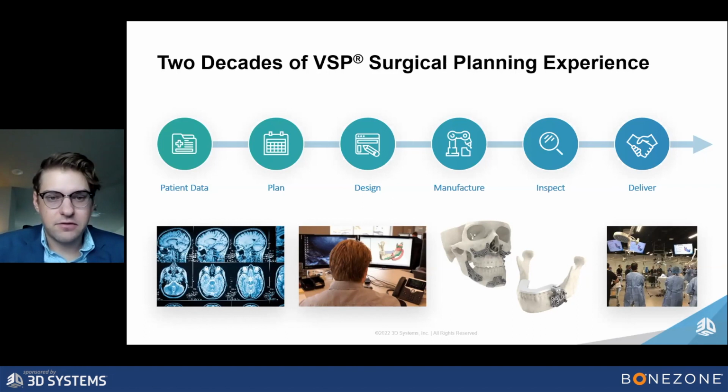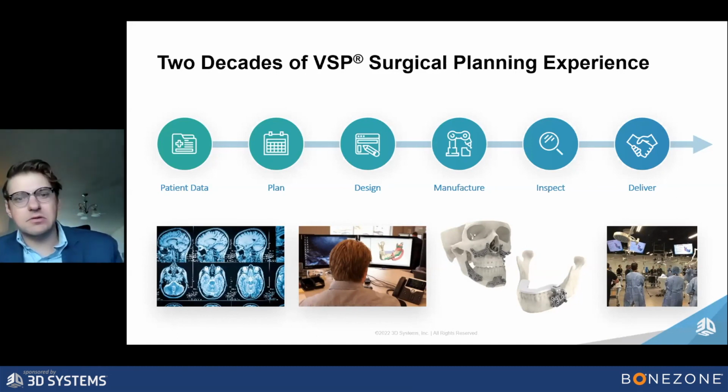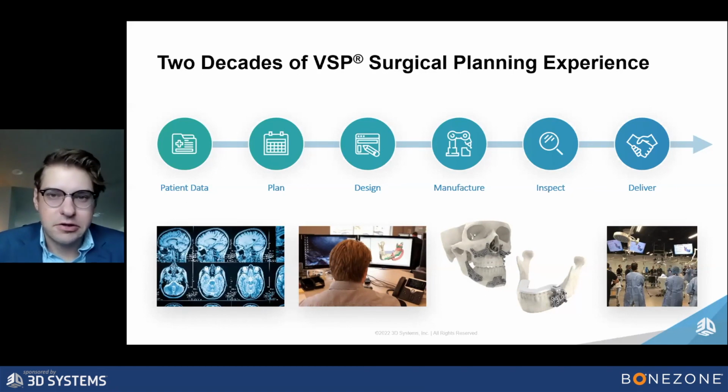From there, we're delivering directly to the sales representative or the surgeons, generally for patient-specific cases. And all of this happens on a very quick timeline because from the day we receive the patient data, there can be changes in the patient anatomy. So we want to ensure that we're delivering products as quickly as needed for these patient-specific devices.